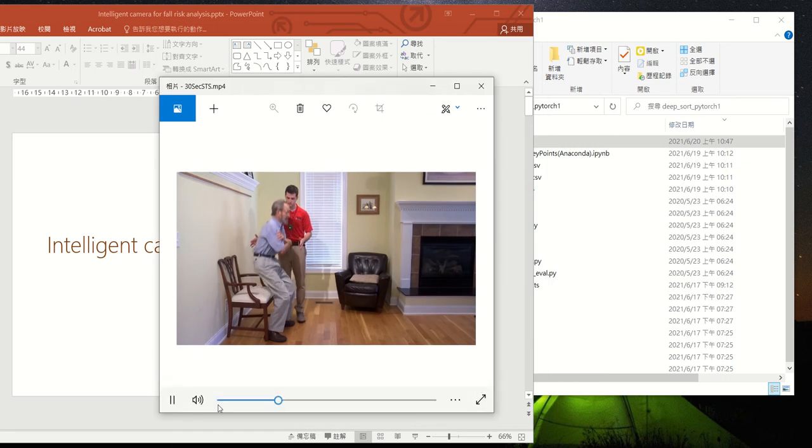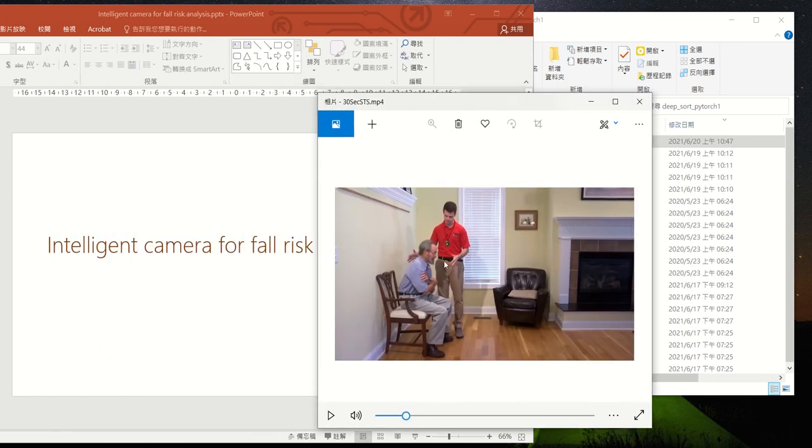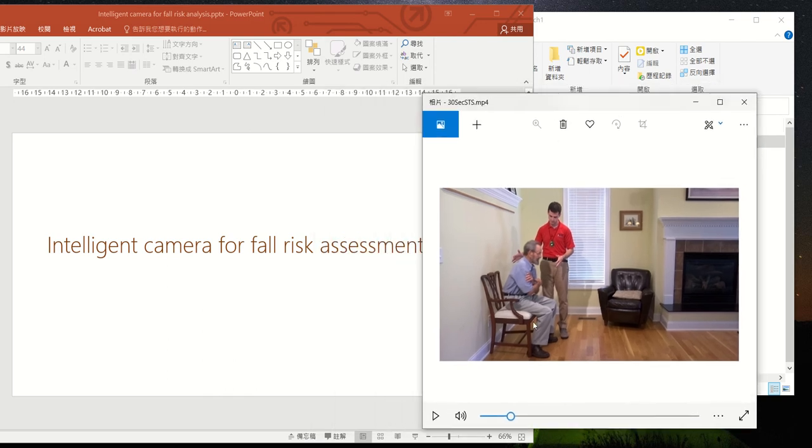It is an example of the 30 seconds sit to stand. We use this as our example. The image analysis we developed can now recognize multiple people. Of course, we still recommend that if the elderly can perform the test by himself, then it is better to shoot just one person. But in case their assistant sits next to the elderly, our intelligent camera can still recognize it.